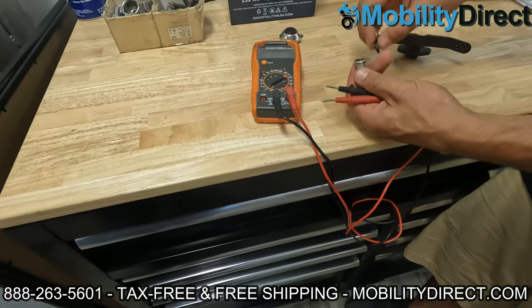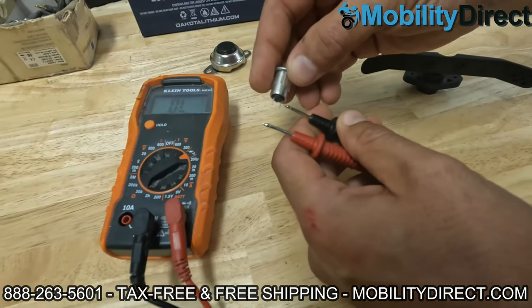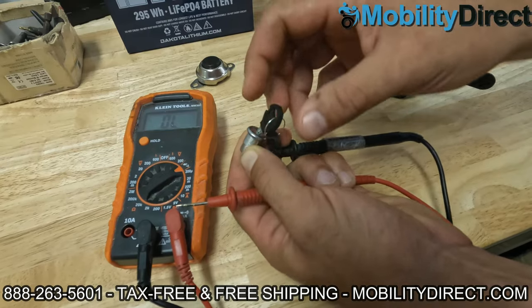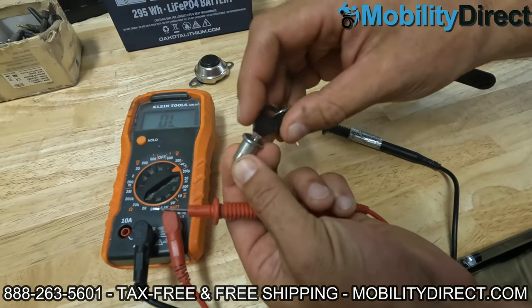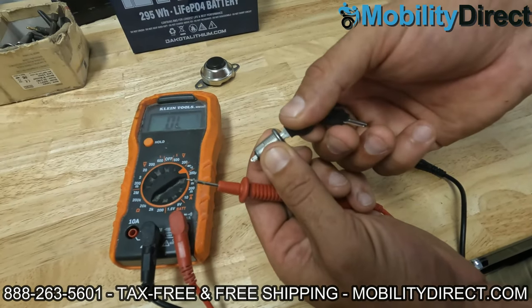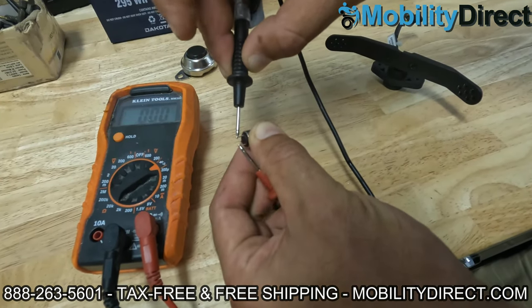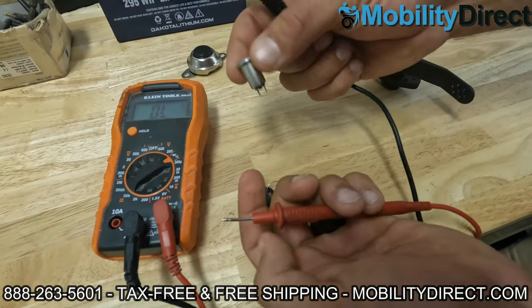I'm going to give you one other example of testing continuity. This is an ignition switch. Right now I have it in the off position, so if I touch the two probes, you won't get a beep — no beep. Now, if I put the key in and put it in the on position, which is clockwise, and I do the same test, you're going to get a beep. That's because all an ignition is, is closing or opening the circuit. When it's off, the circuit's open; when it's on, the circuit is closed — basically like connecting the two wires. So right now the ignition switch is on, and if I touch the two probes, it beeps, because it's making those two wires connect by closing the circuit. That's how you would test an ignition.